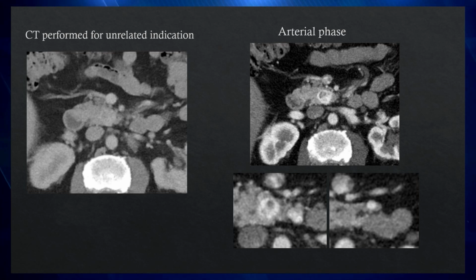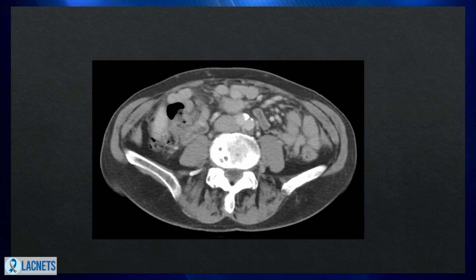So that's why in the evaluation of neuroendocrine tumors of the pancreas and liver, which are both in the abdomen, we need multi-phase imaging with arterial and then venous phase. Now, how about the small bowel? The small bowel is really tricky, even for the trained eye, and that's why tumors there can be missed initially on imaging until they grow further.